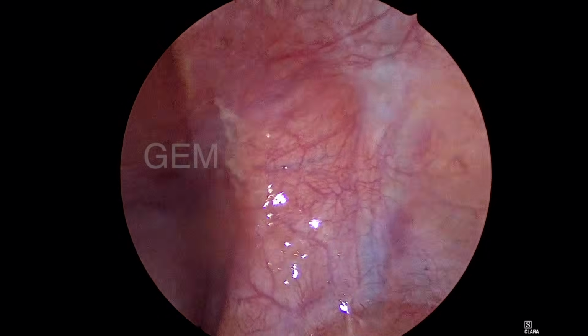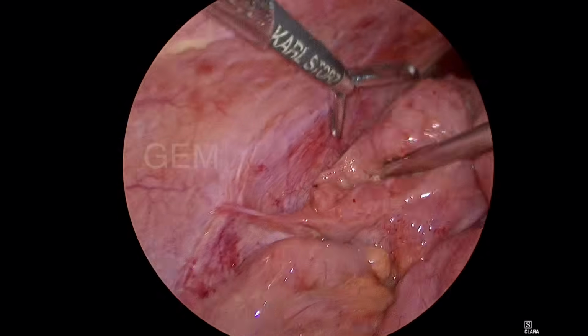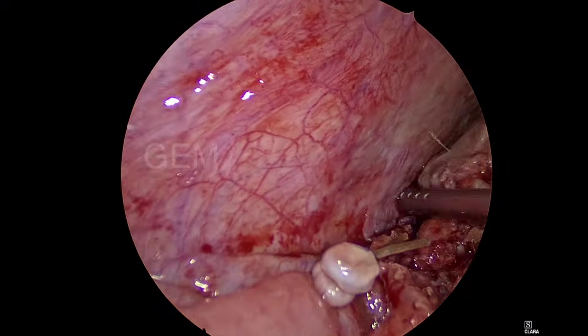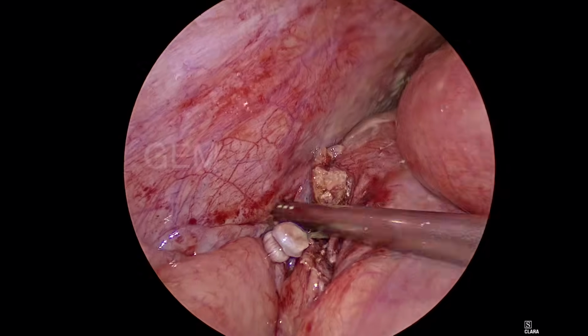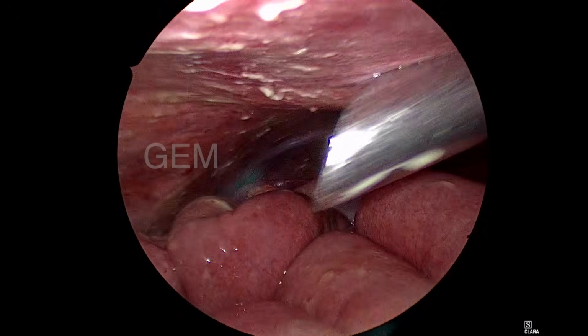Now I am going to the cecum, the paracolic area, looking for the divided appendix stump. It's good. So in the paracolic area, you can see all the plaques are removed. You can see the cecal wall. The appendix was adherent to the lateral wall of the cecum.